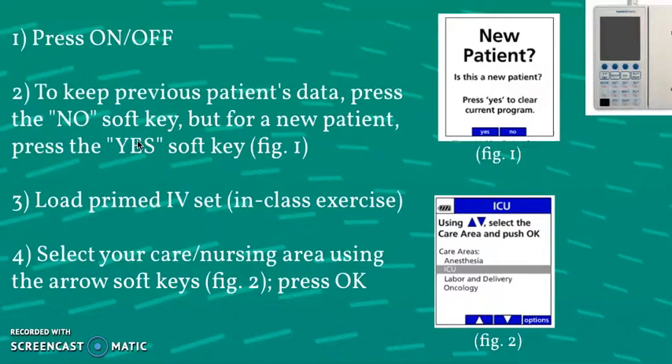Next, you'll be prompted to select a new patient or not. To keep the previous patient's data, just press no, but to program a new patient's data, press yes. The next step in reality would be to set up your IV line and insert it into the IV Line door, but we'll practice this in class. Then you'll select your care area or floor using the blue arrow soft keys and press OK to confirm.